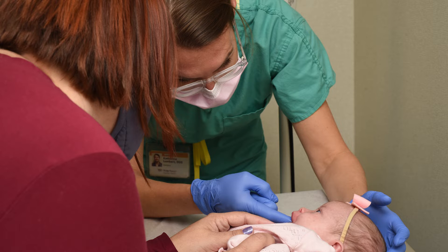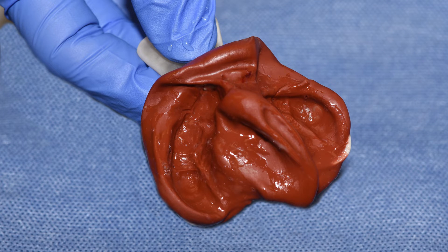The NAM is a custom-made individualized therapy, which first starts by taking an impression of your baby's mouth, similar to the impression for adult braces or a retainer. The impression is then used to make a model of the inside of the mouth, from which all the components of the NAM appliance are fabricated.